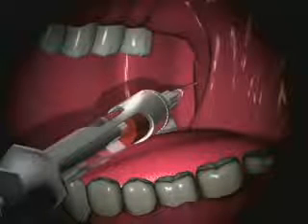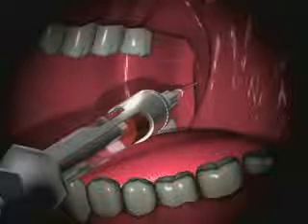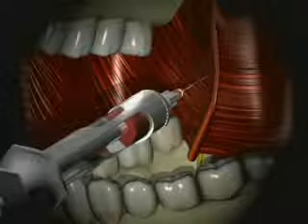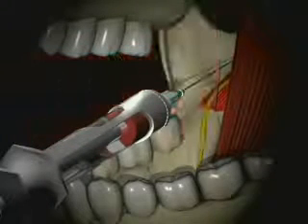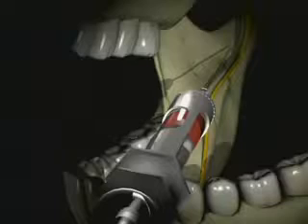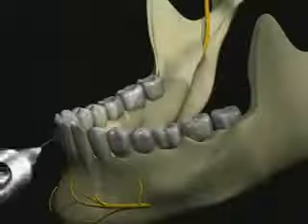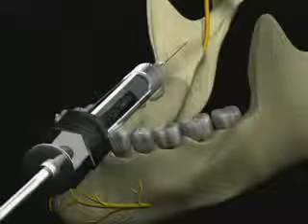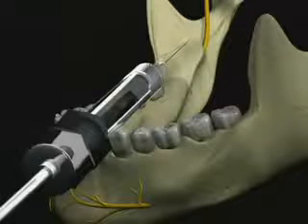The needle is now passing through mucosa, a thin portion of buccinator muscle, loose connective tissue, and adipose tissue. It lies lateral to the medial pterygoid muscle and the sphenomandibular ligament, and medial to the ramus of the mandible. If you contact bone too soon, in other words, significantly less than 25 millimeters, you will need to redirect the syringe and carry out the indirect technique.